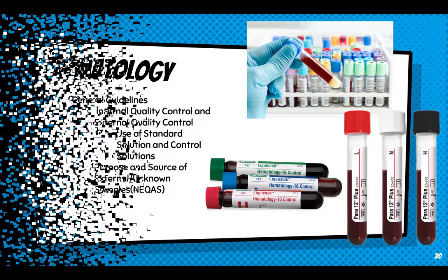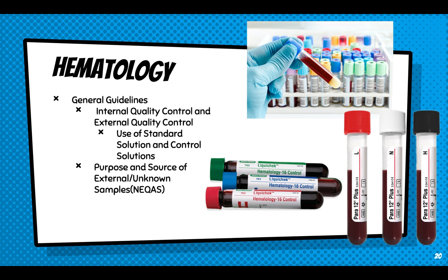For your hematology, we actually have the same. We also have internal quality control and external quality control. Before you run your sample, the first thing you need to do is to always run your QC. So, a review: what is the objective of your QC? I'll give you 10 seconds. Okay, time's up. Is that 10 seconds? Of course not. But technically, the main objectives of our QC, all together now: to check the stability of your machine, to check the quality of your reagent, and of course, to also assess the competence of your technical staff.